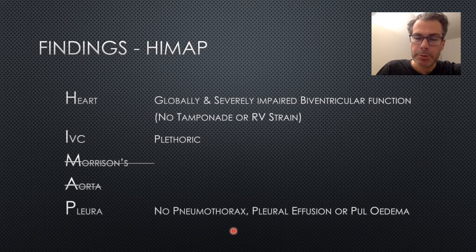And I think this was really useful. Of course, he got a formal echo later in the day, which gave an exact ejection fraction. But right from the beginning of this case, the whole team knew the diagnosis. We were able to get him on the right treatment right from the beginning. We didn't need to waste time and effort with other investigations. We could explain to the patient what was going on, what was the working diagnosis. And so in this case, I thought the point of care ultrasound added a lot to his management.